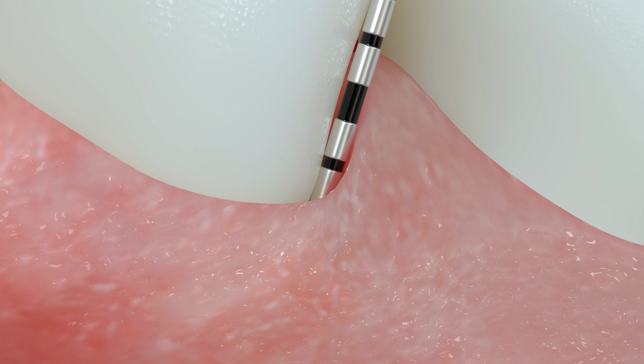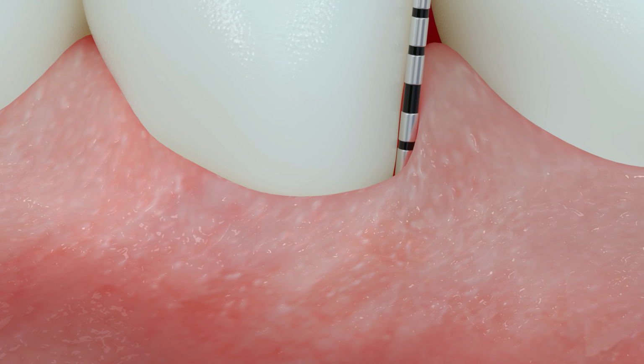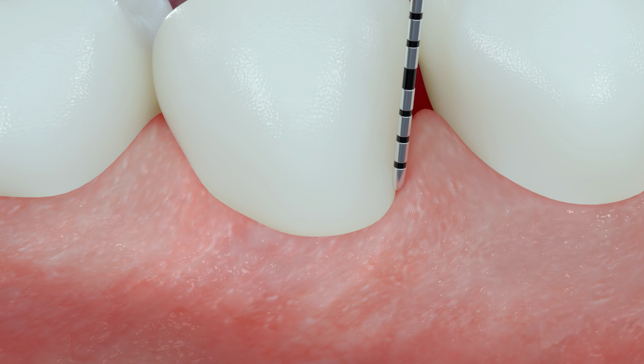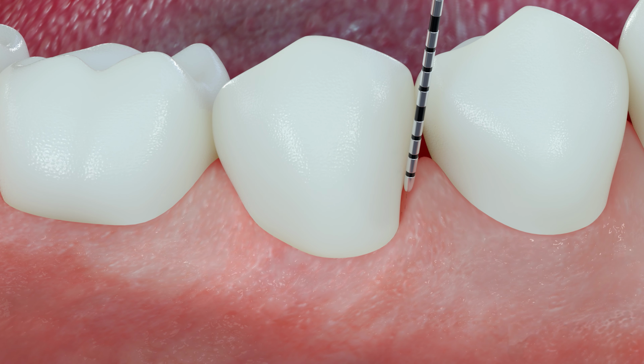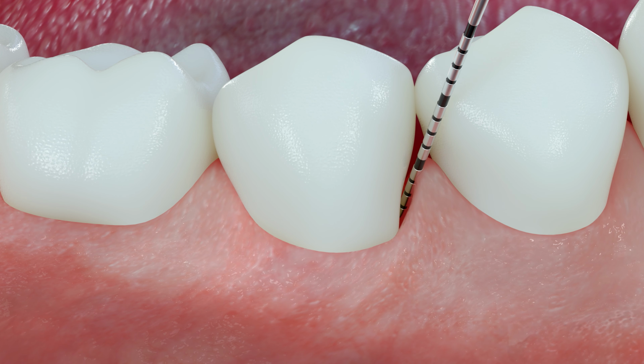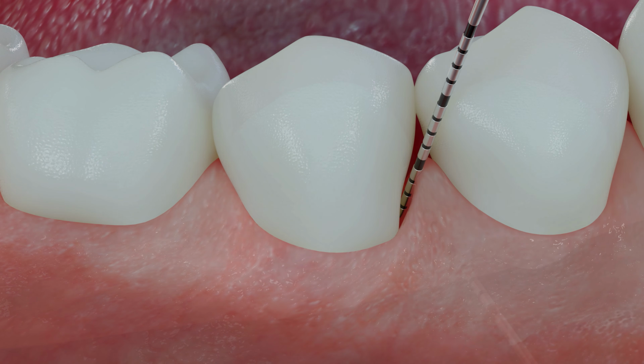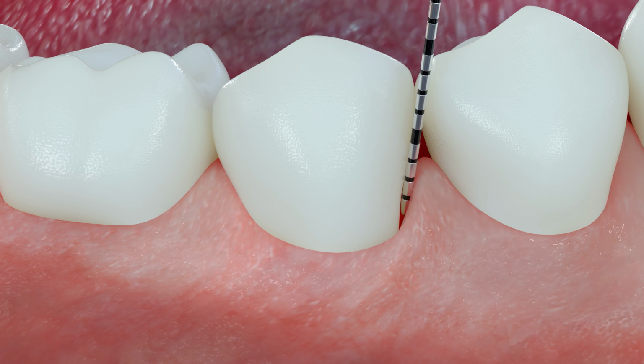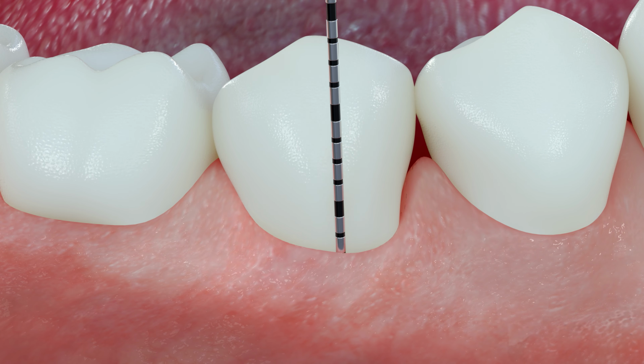Gently insert the probe into the sulcus. Probe along the long axis of the tooth, extending towards the attachment level and not the sulcus wall, with typically around 20 to 25 grams, which is roughly equivalent to the weight of the probe itself. In healthy tissue, resistance is felt at a depth of 0 to 3 millimeters, as shown here.